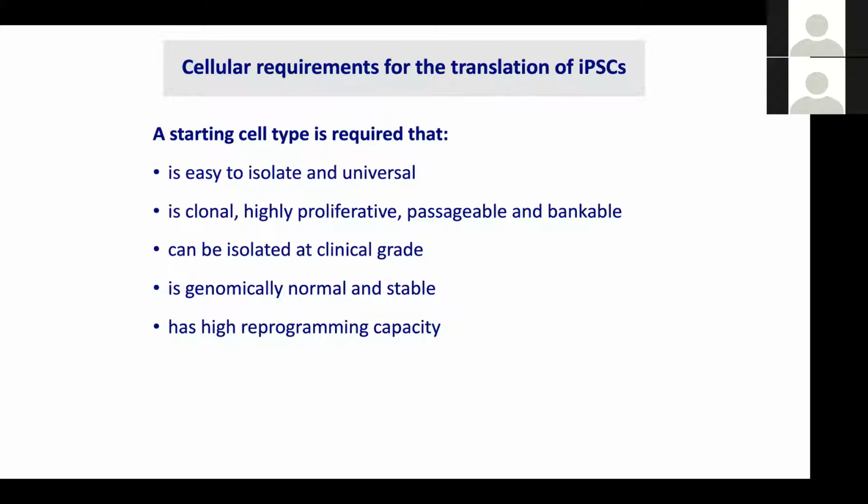The downside of this is that when you then produce your iPS cell clone, which would have come from just one of those thousands of cells you have in the mix from the original biopsy that you took, when you try to look at the genetics of that cell and what changes may have occurred during the process of reprogramming, you have to compare your monoclonal iPS cell to your polyclonal population that it was originally derived from.